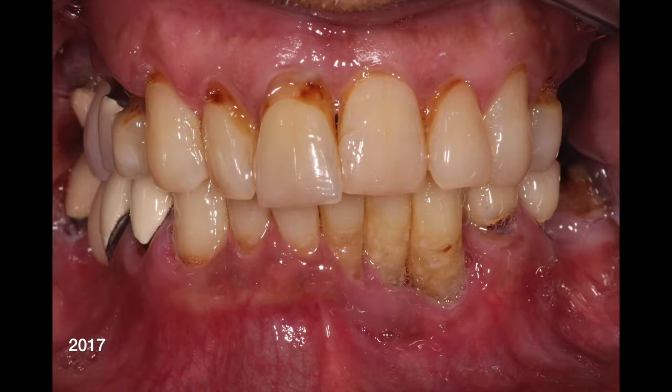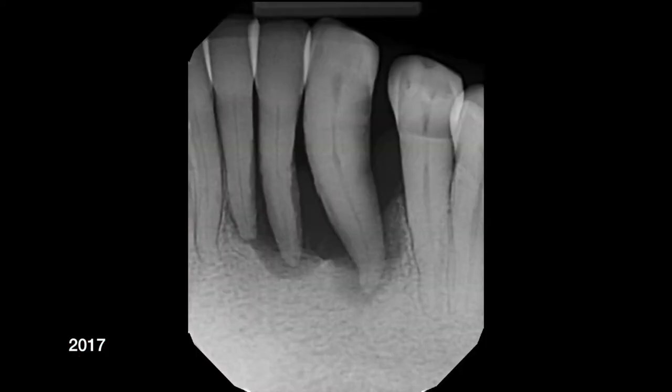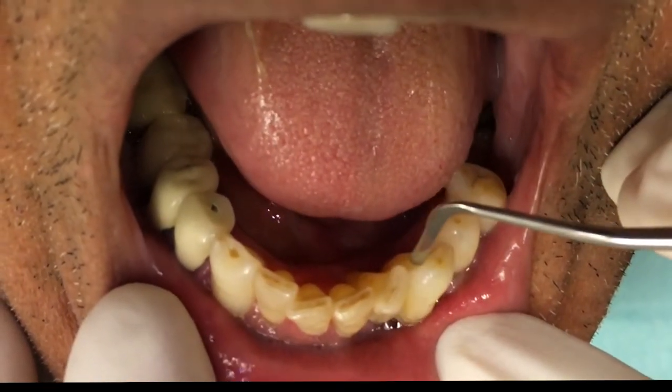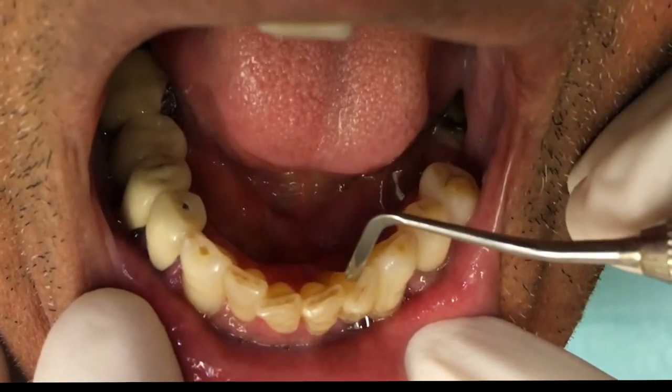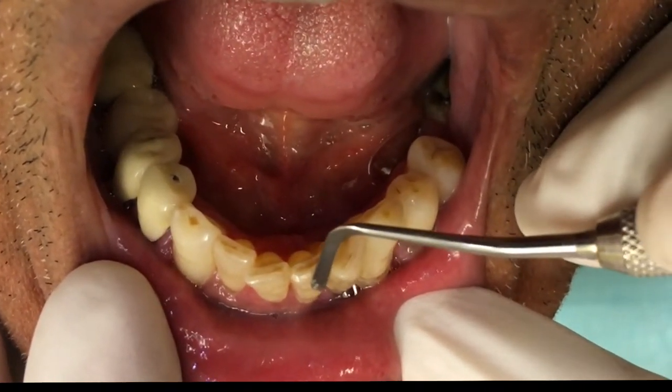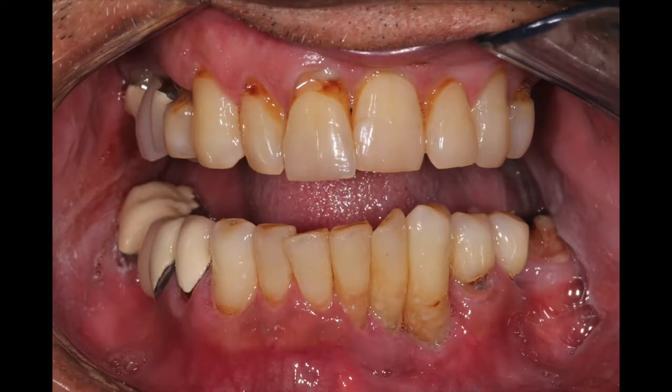Number 22 is just barely holding on. Number 23 is pretty much floating in just soft tissue, and number 24 is not looking that great either. Looking at this part of the video, you can see these teeth are highly mobile, and there's quite a bit of rotation that's happened since we saw him way back when.